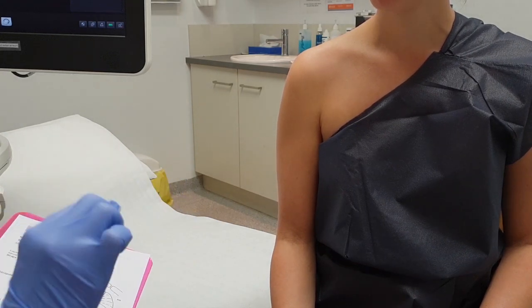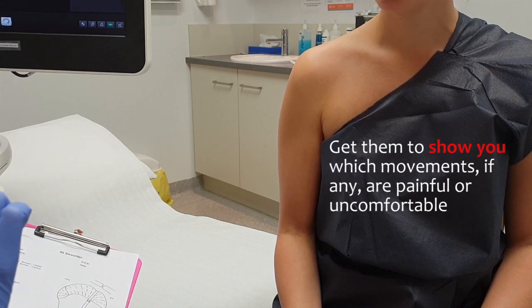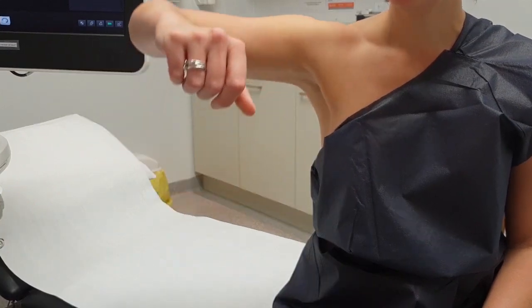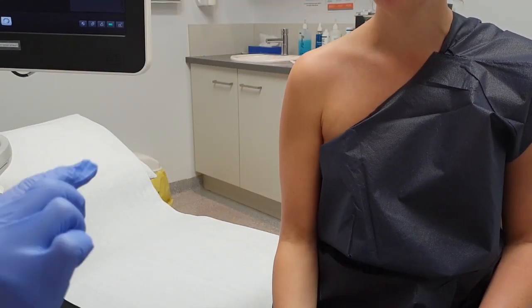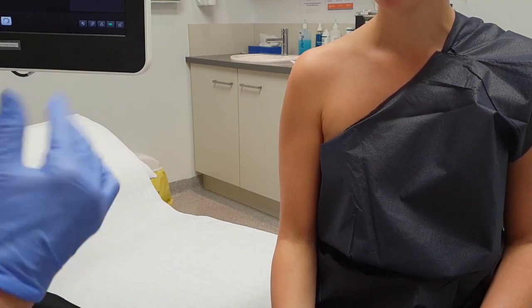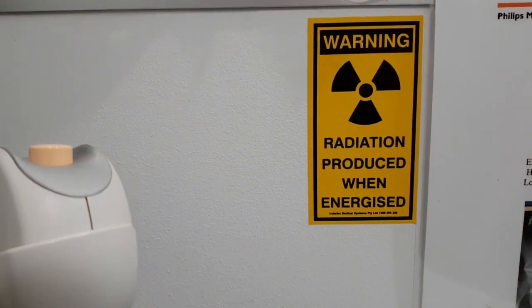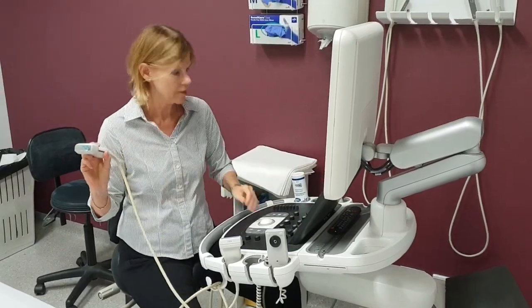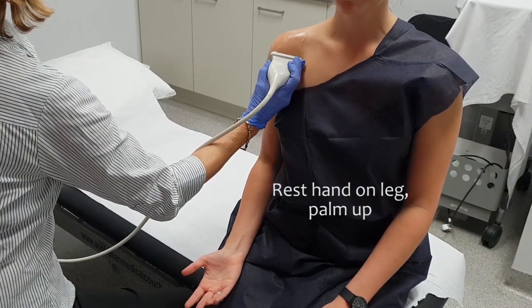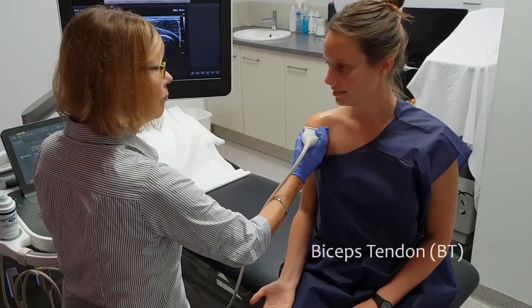Is there any particular movement that actually aggravates your shoulder more? Generally it's with this movement, anything up above the head. What I'm going to do is have a look at your shoulder with ultrasound. As opposed to X-rays, which shows the joint space and the bony margins, I'm going to use sound waves to look at the tendons and the overlying bursa of your shoulder. We'll start by just having your hand nice and relaxed on your lap, and we start with the biceps tendon.